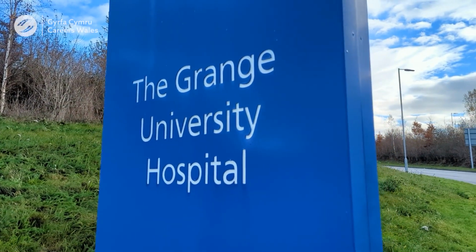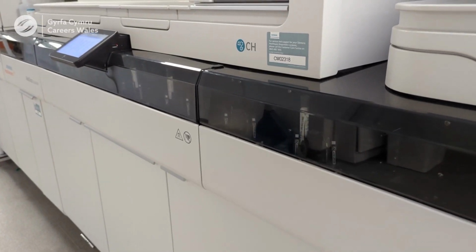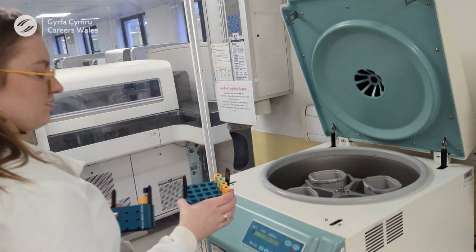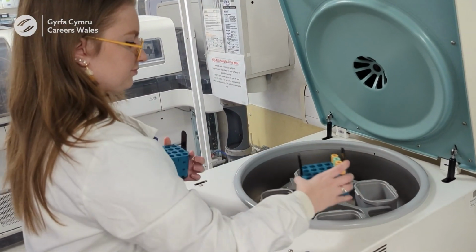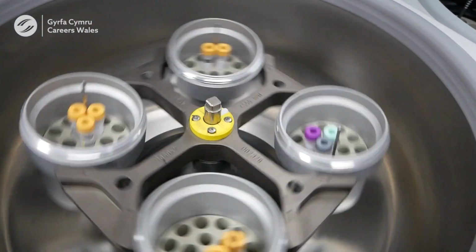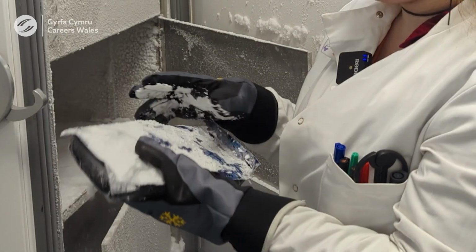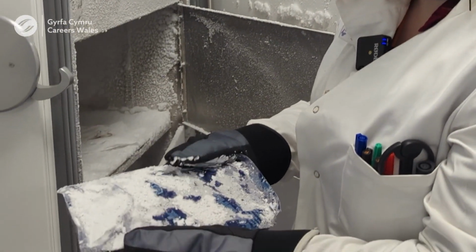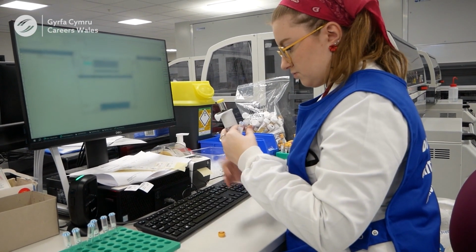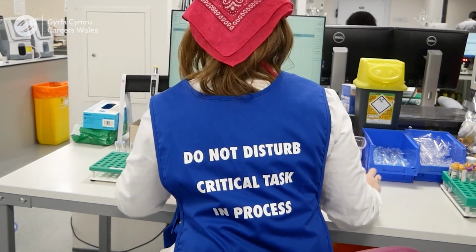We've got a big track system, so it's like a big conveyor belt which takes all the samples to the analyzers. Sometimes we need to do specific prep for them, spinning them within 15 minutes and separating the plasma from the blood. Sometimes you need to freeze them, sometimes you need to split them because they go into different hospitals. And then we also have this section called special chemistry, where we have different analyzers that aren't on the track system that need special samples, or they need to be done in a certain time.